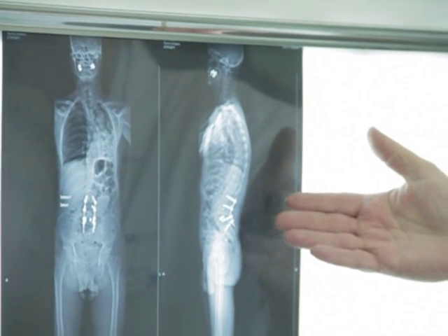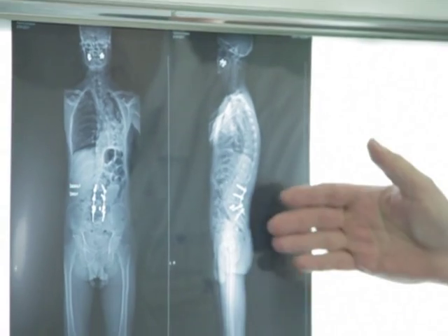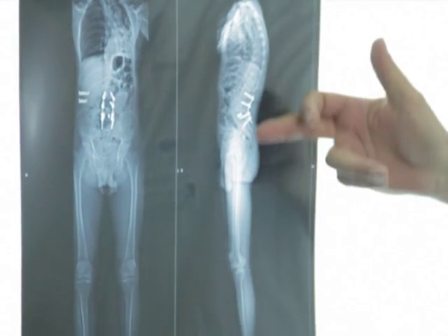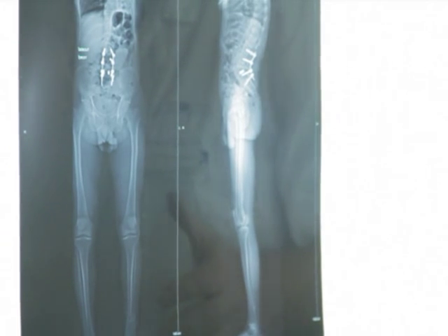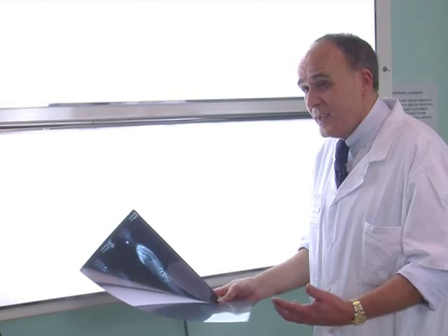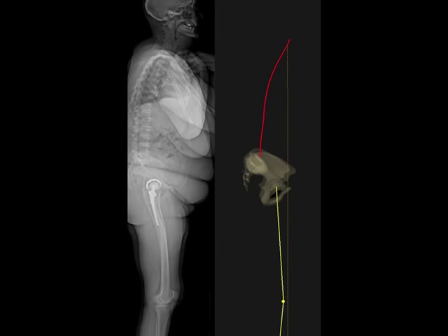We did only the spinal correction — the wedge osteotomy — and you can see that this spinal correction induced a correction of the lower limbs without doing anything on the lower limbs. So it's easy to explain the approach pre-operatively but also to explain the result post-operatively.